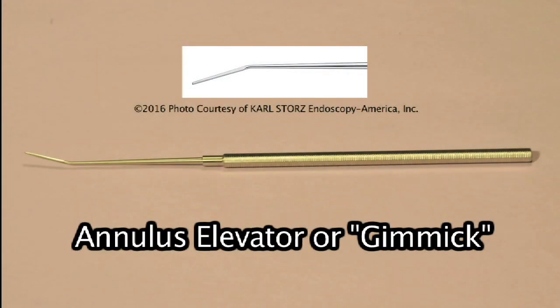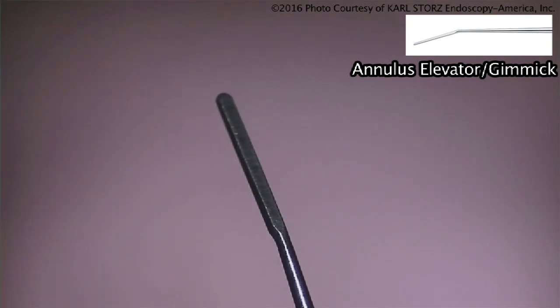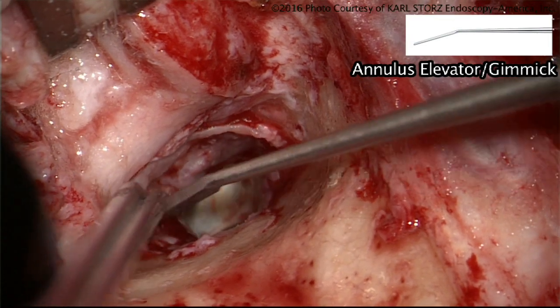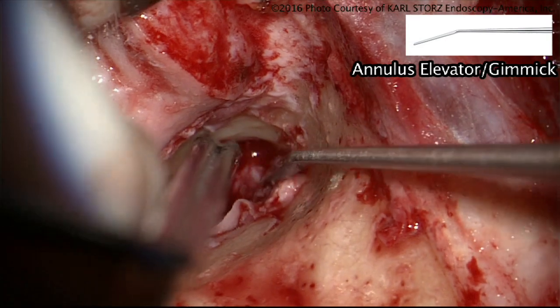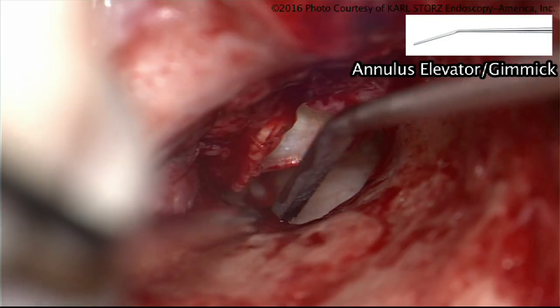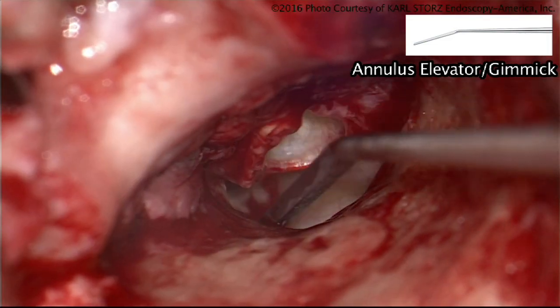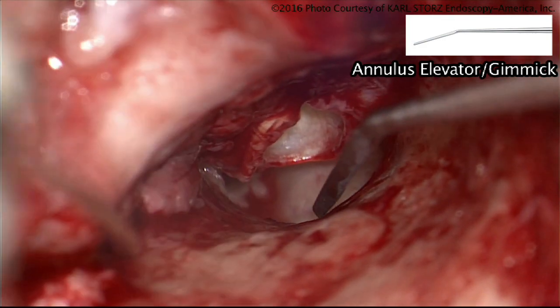We call this a gimmick because it is so useful for many things. We use it as an annulus elevator, but we also use it to dissect the dura. Once you have the ear canal skin elevated to the level of the annulus during stapedectomy, you can sweep this around to elevate the annulus. I use the gimmick more in skull base surgery than in middle ear surgery. It does not have a sharp surface, so it tends not to stick to structures — very helpful when you want something blunt.